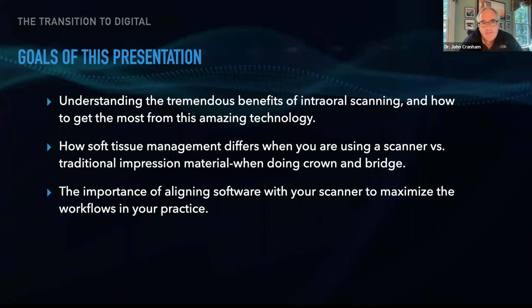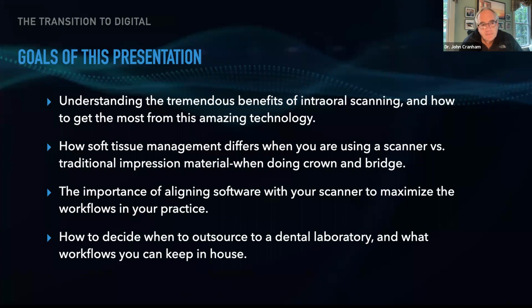So you can talk about some different things, but knowing your own practice and the things that you want to do, the more you can manipulate the data in-house, maybe train your assistants to manipulate the data in-house and do various things with it, you can start creating outputs, whether it's a bite splint or a wax up, or maybe even you're going to get a mill and start to design and fabricate permanent restorations. And the people that I'm coaching now, I've got all the variety of people using different things.